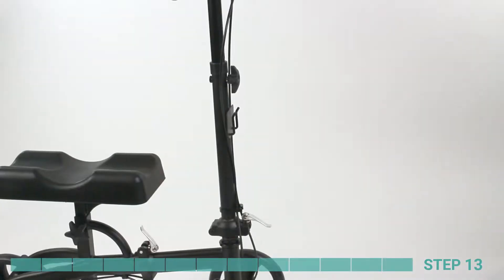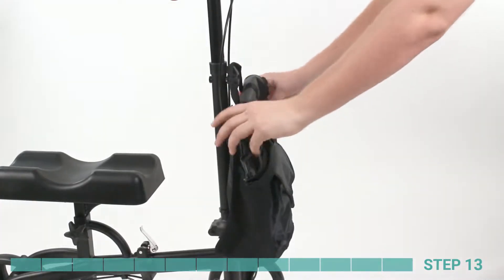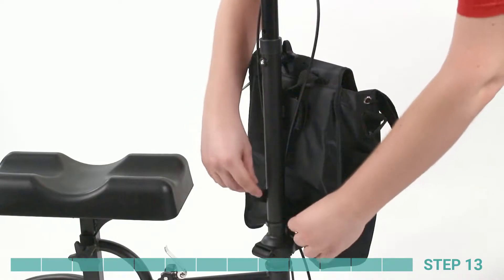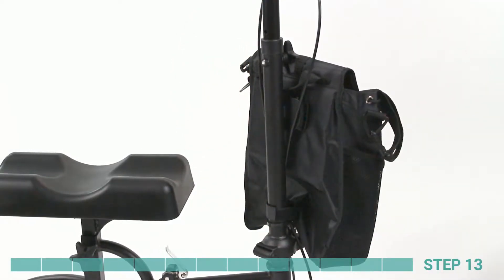Step 13. To install the bag, fit the hooks on the steering column into the loop in the back of the bag. Open the Velcro straps at the bottom of the bag and secure them around the steering column.